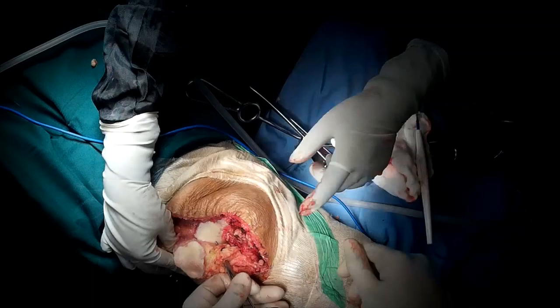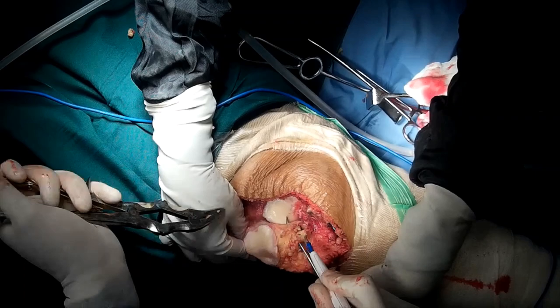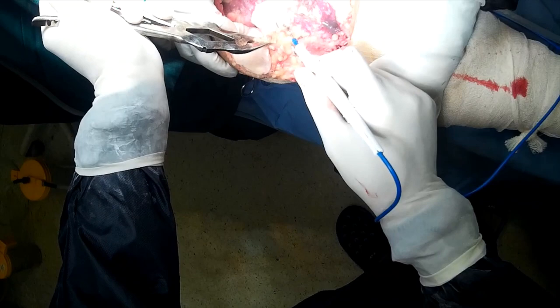Now we excise the fat pad which is situated over the inferior aspect of the patella so that patellar tendon is visible and lateral structures of the knee joint are visualized.